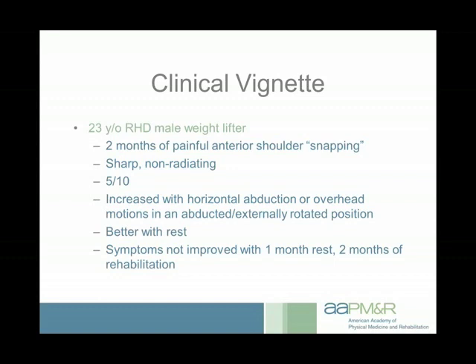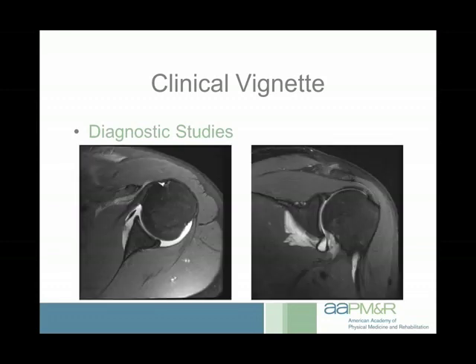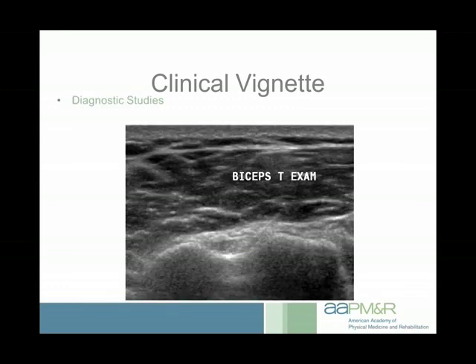His symptoms felt better during the month off, but the second he returned to weightlifting the snapping came back. He went to rehab for a couple of months with no improvement. My partner got x-rays — normal — then suspected a labral tear or soft tissue pathology and ordered an MRI arthrogram, which didn't show any significant pathology. He was sent to me for ultrasound specifically to look for a dislocating biceps tendon. I first looked at the biceps: here is lateral and medial, the lesser tuberosity, greater tuberosity, intertubercular groove with the biceps tendon sitting in it, the transverse humeral ligament over the top, and the anterior deltoid. His tendon looked normal with no effusion, tendinopathy, or tenosynovitis.